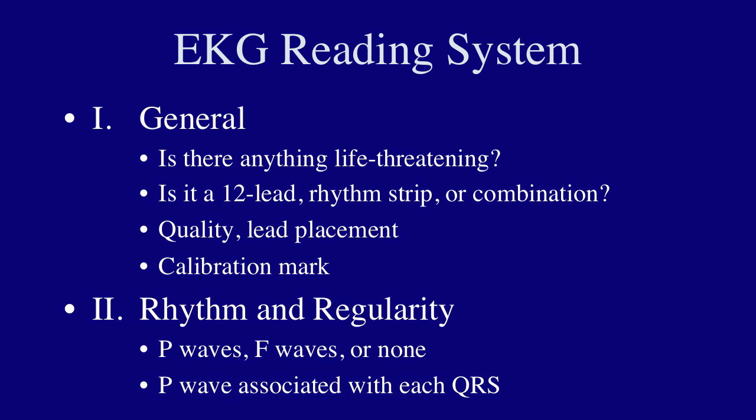So basically, what are you looking at? Then you look at the quality. Is it something that has a lot of artifact, or is it fairly easy to read? Usually the EKGs at rest that come right out of the machine are pretty clear and good quality. If you're doing exercise, you might have a decrease in quality.